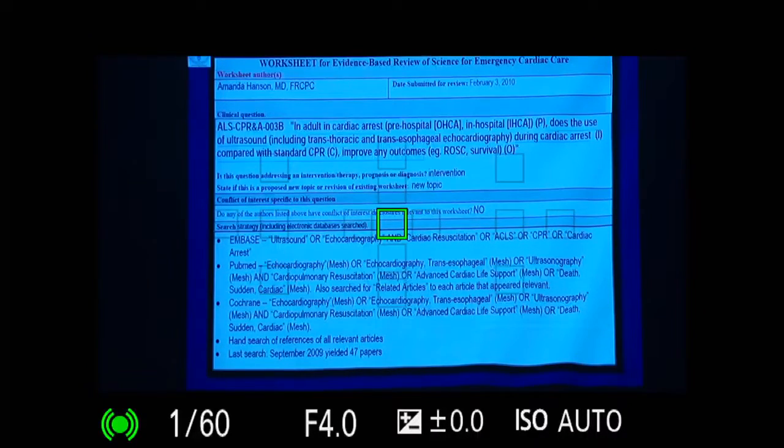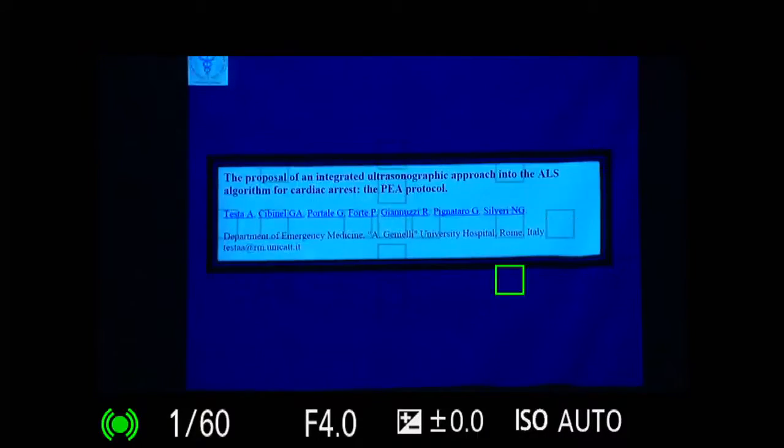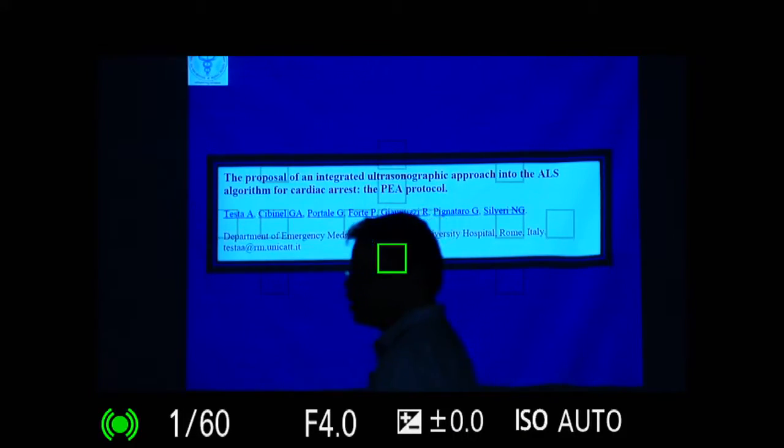Okay. So, I looked at this while we were doing ultrasound guided CPR in the very early years. I looked at the literature, at who is doing what, using the search engines. Besides what we said, you can also use it in transvenous pacing. You can make a fine distinction between fine VF and asystole, because the protocol changes. This is what I looked at to see what we can do in pre-hospital care.